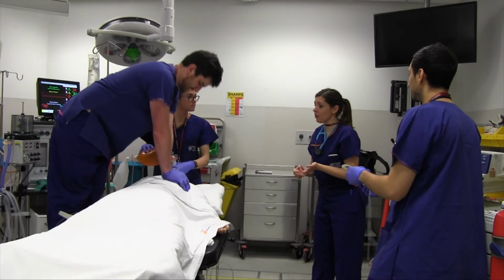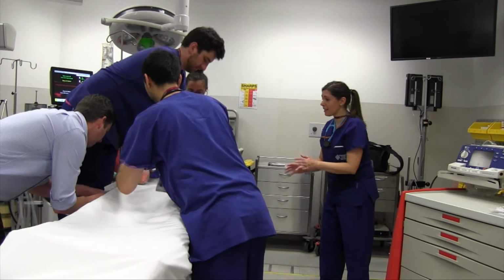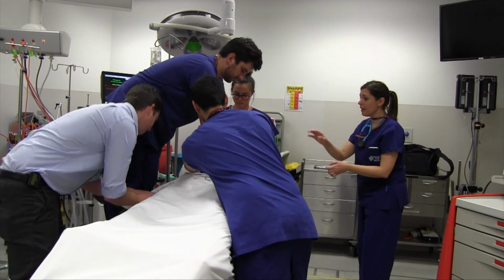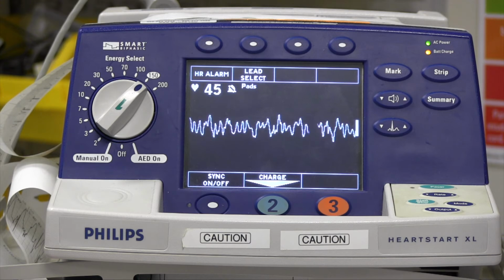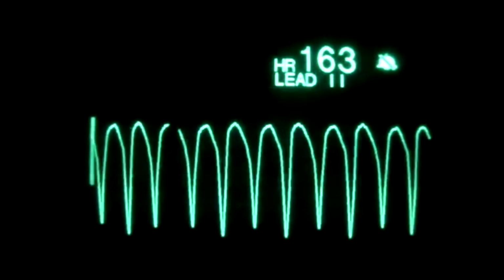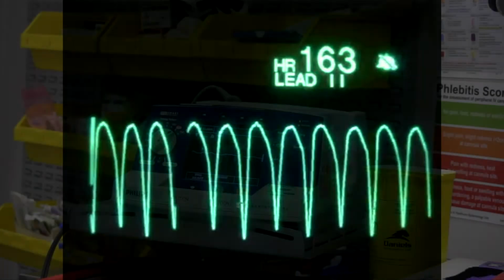The arrival of the defibrillator moves us forward in the algorithm and determines the electrical and pharmacological therapy required. CPR can continue whilst the pads are being attached. Shockable rhythms include ventricular fibrillation, discoordinated electrical activity not associated with a cardiac output, and pulseless ventricular tachycardia, a broad complex rhythm of rapid rate with a constant QRS morphology. It may be monomorphic or polymorphic.